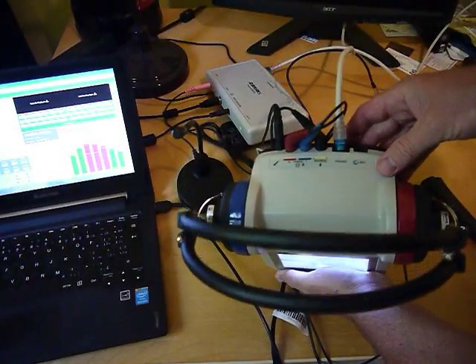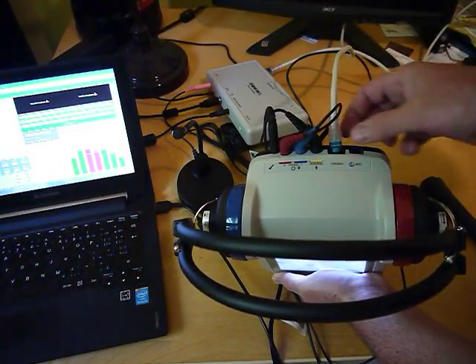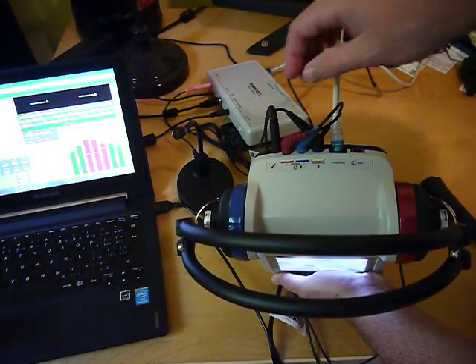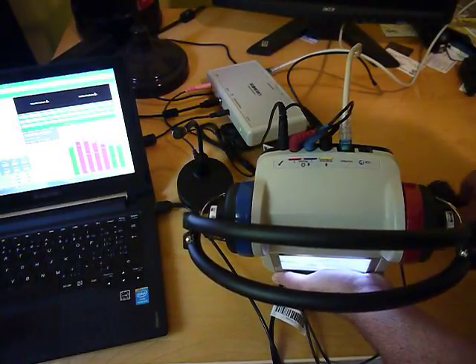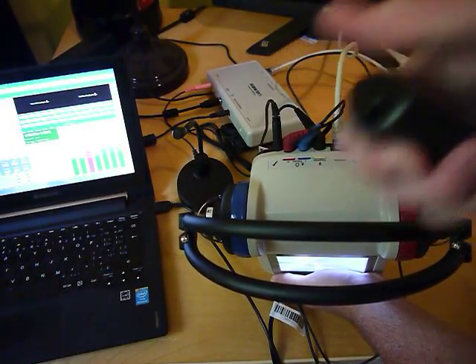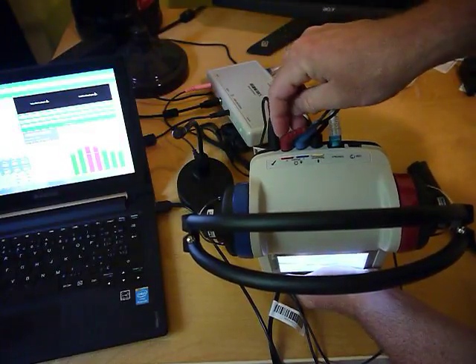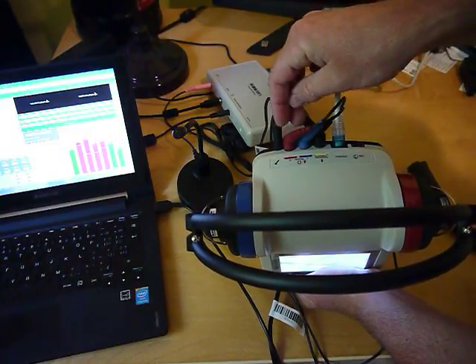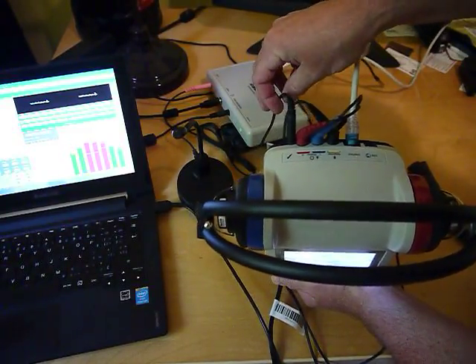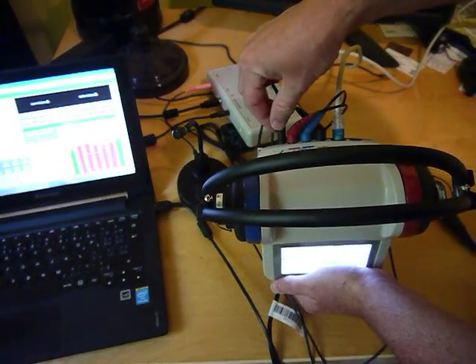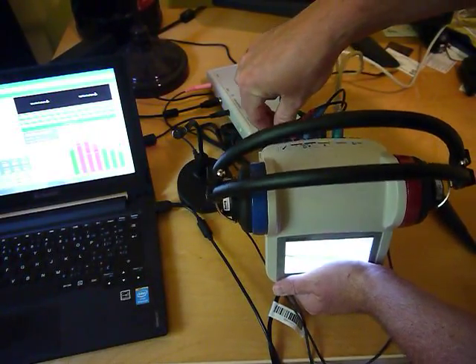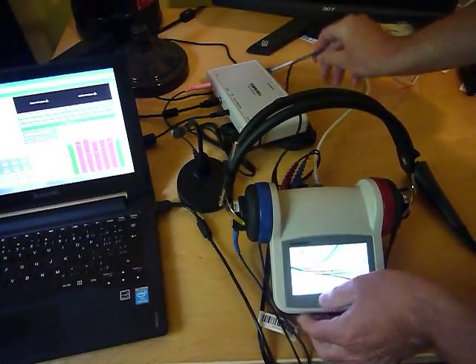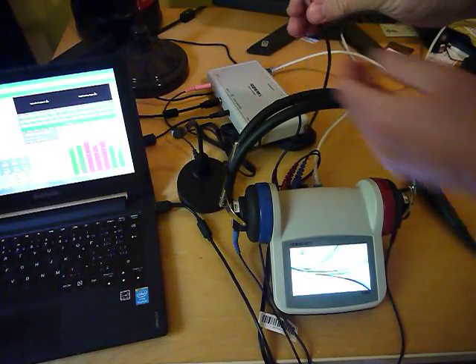On the back here is the connection from the interface box, the response button connection, and the left and right headphone connections. We also have this optional room noise monitoring microphone which is right here.